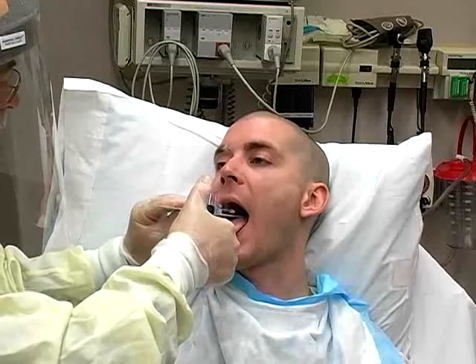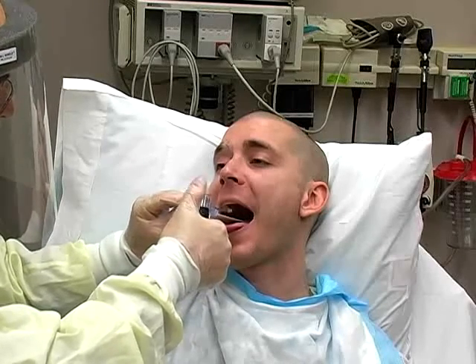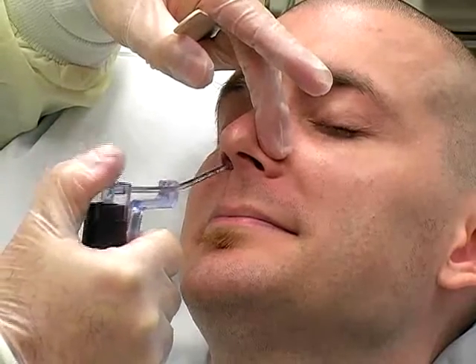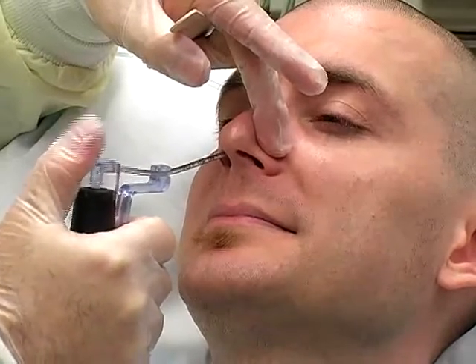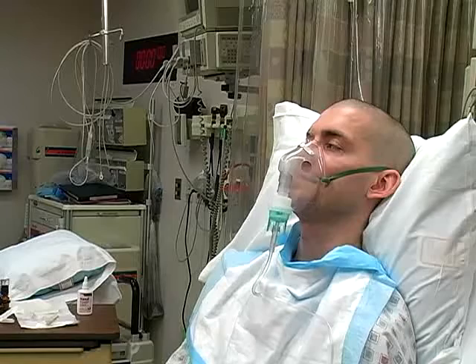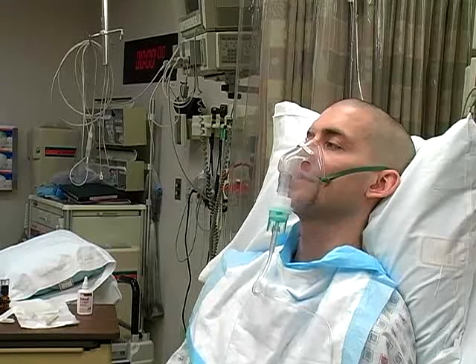There are several options available for topical anesthesia. 4% lidocaine can be administered to the oral and nasal mucosa with an atomizer. The amount of lidocaine required is not established. However, 3 milliliters for the oropharynx and 1.5 milliliters for the nasopharynx should be adequate. Alternatively, 4 milliliters of 4% lidocaine can be administered via a nebulizer.